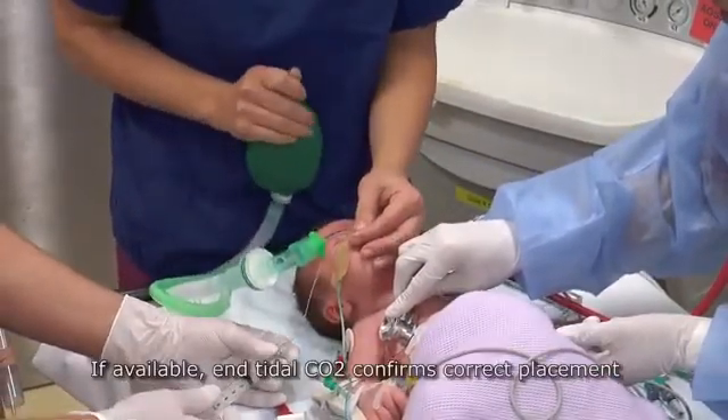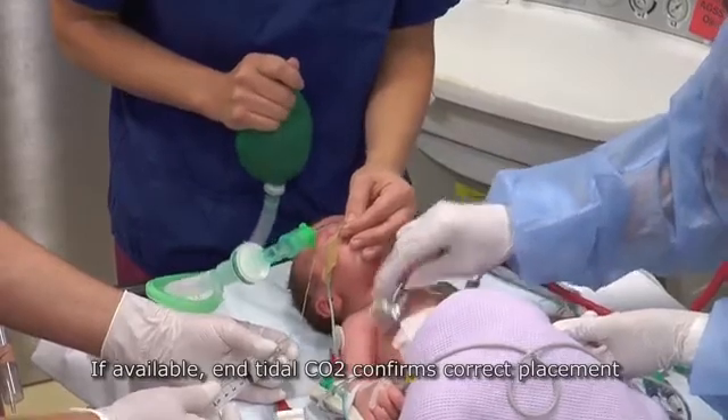If available, end-tidal carbon dioxide confirms correct placement.